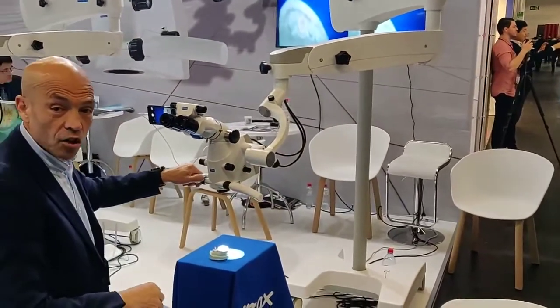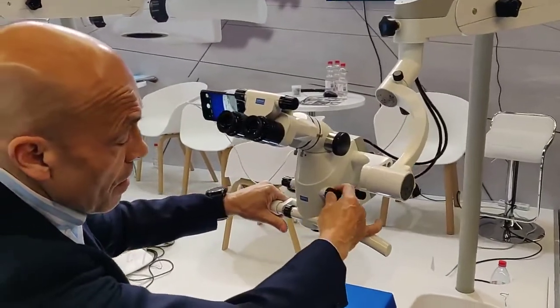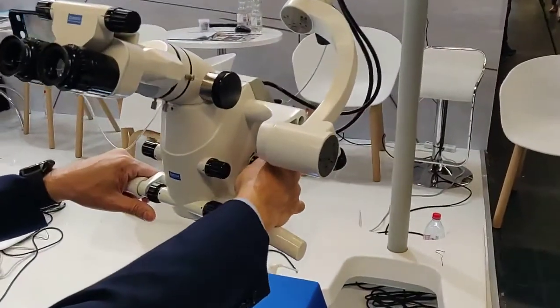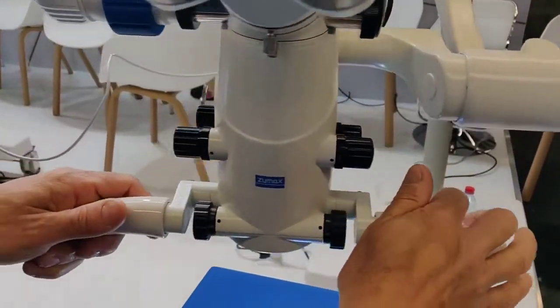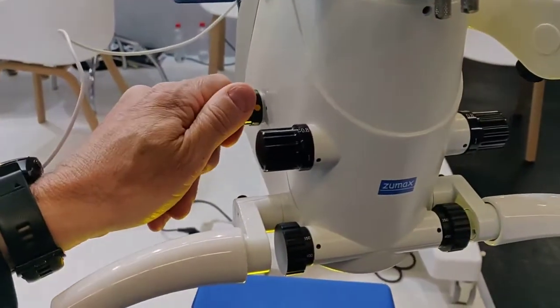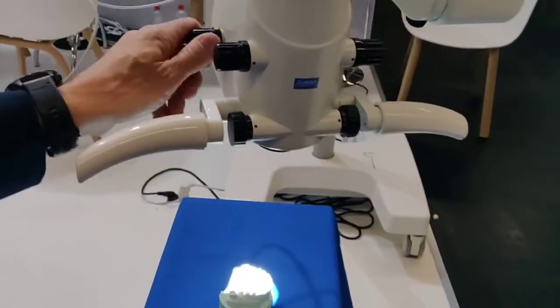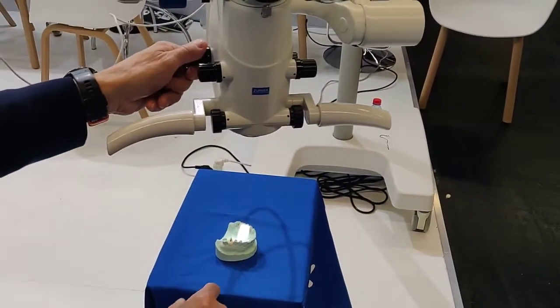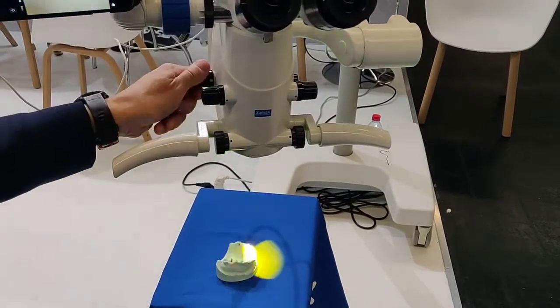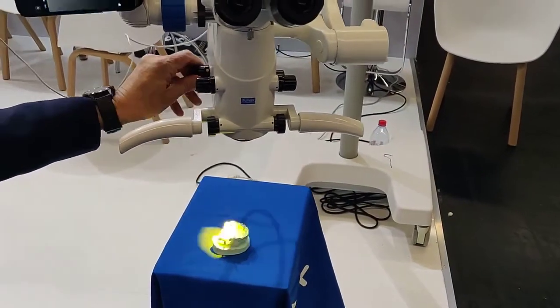Moving on to the use of the microscope: we have here the vario distance control, the zoom magnification, and the light control. On the left side, we have the field of view with the filters. You have the filters and you can see the color. For the field of view, we have four steps — one, two, three, and four — plus the filters.